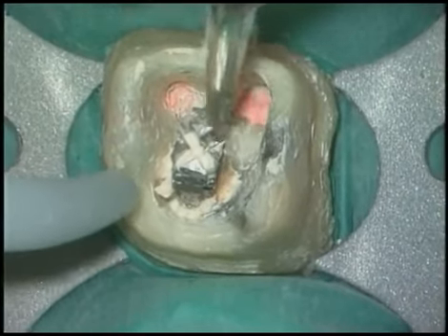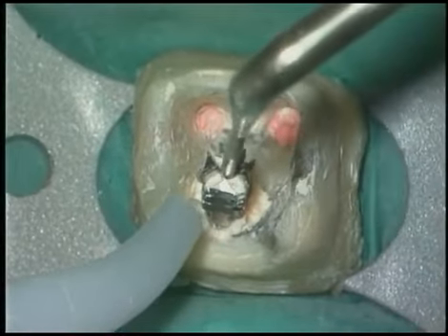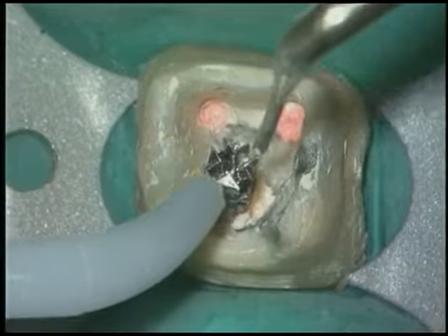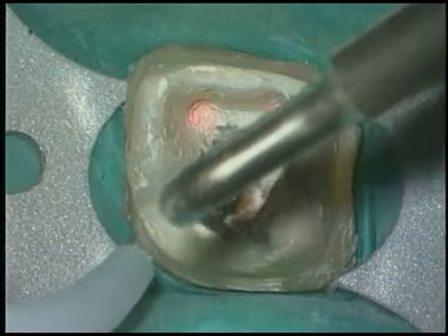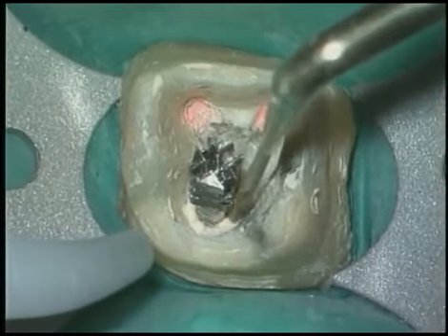The post is progressively freed up, and as we work into tight areas, like between axial walls, or like in this case, the head of the post, we'll go to a Pro Ultra Endo 4. This is used at the lowest power setting that will efficiently accomplish the clinical task. Its small profile can work easily between the post and an axial wall, and in tight spaces where the larger Endo 2 would have trouble.